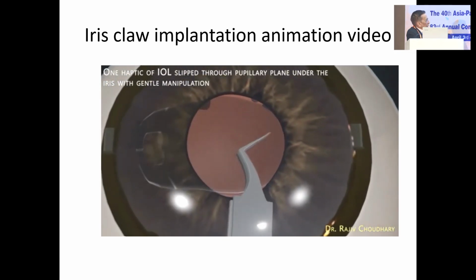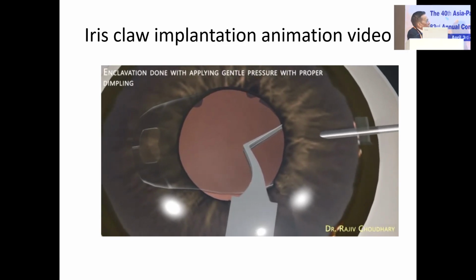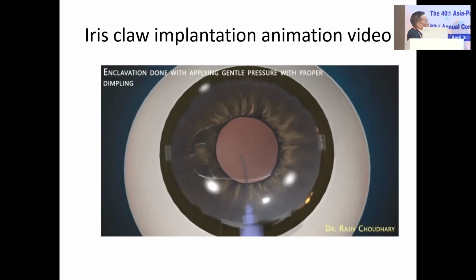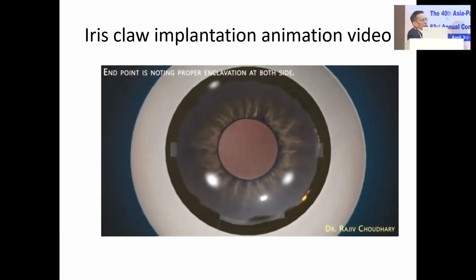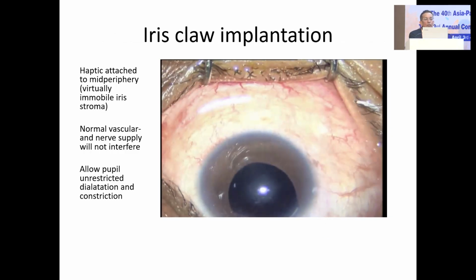Grab from the side which you have to enclavate. It is important that you hold the lens firmly, because when tucking, it will go down. Again refill, hold from the other side and hold the lens firmly, so that you can very easily complete the surgery. So you can see how simple it can be in traumatic cataract.